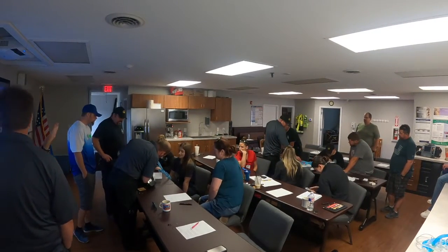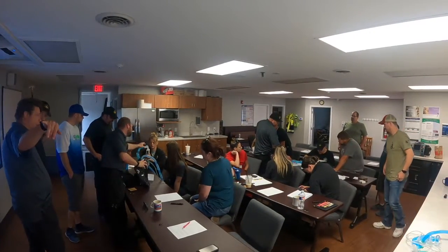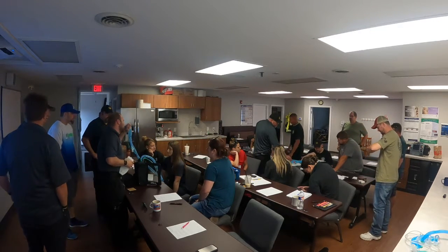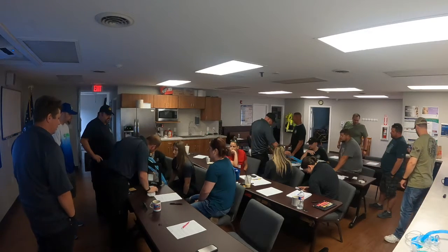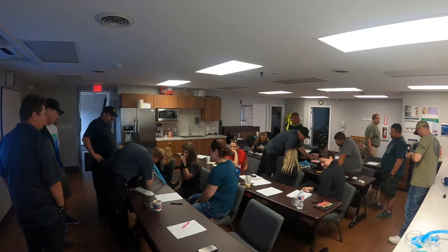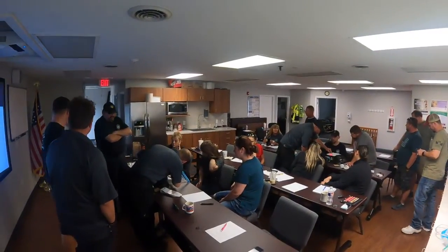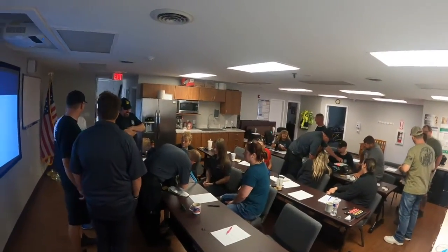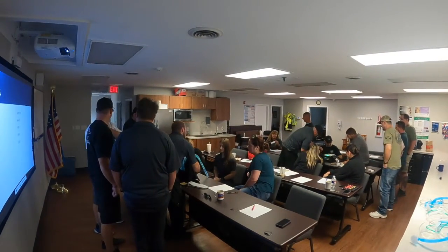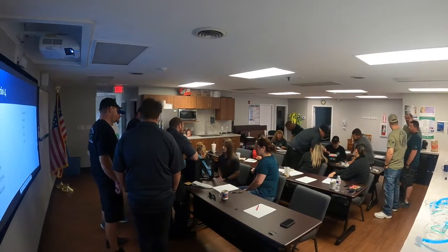Turn on. What's it say? No patient detected. So, you guys want to test your high pressure alarm? It's working. Cover it up on the end, just to seal off the ends.